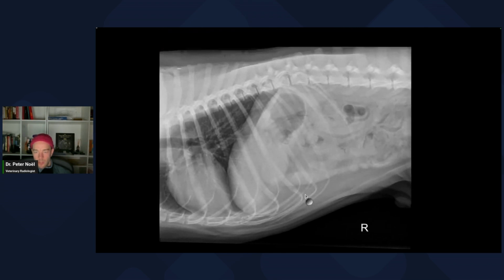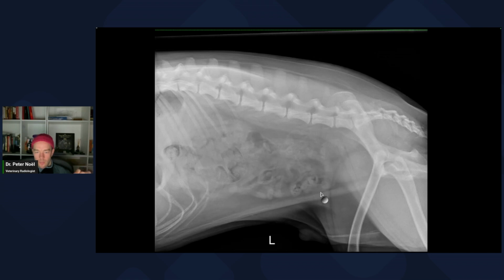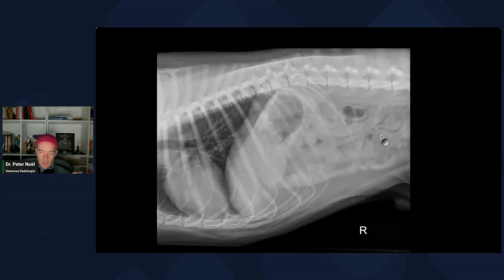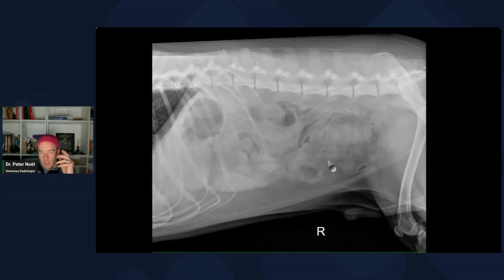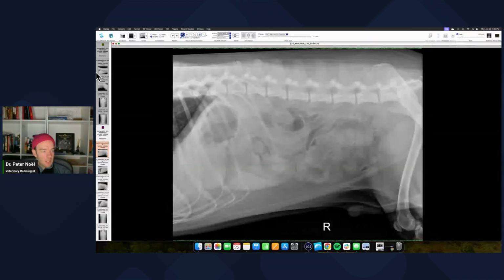Sometimes what I'll do is, you've got the small intestine here, and then when you go to this view, I'll still cheat, and you kind of look over and you go, well, what's it doing over there? Is it doing anything funny? And wow, the corrugation kind of goes away, right? So if it's not persistent on these lateral views, first of all, the loops are not overly distended. Maybe there's some corrugation that worries you. Maybe it's plicated. Maybe there's a linear component. And so what the folks did in this case is they just brought him back.